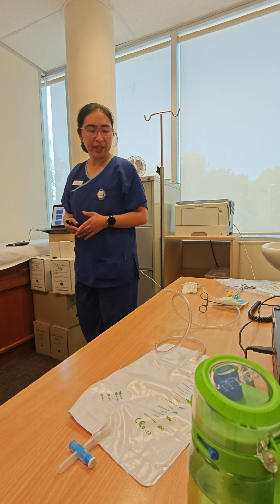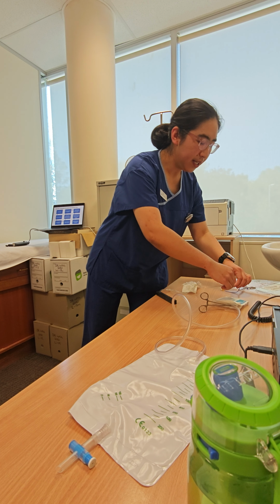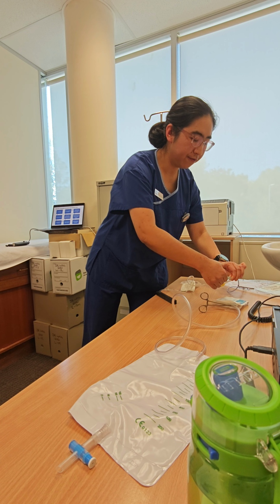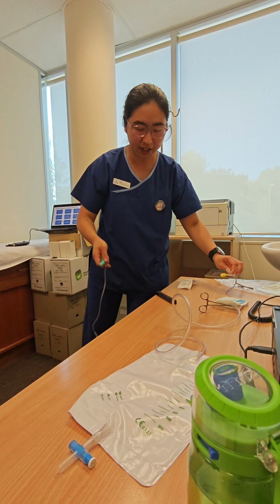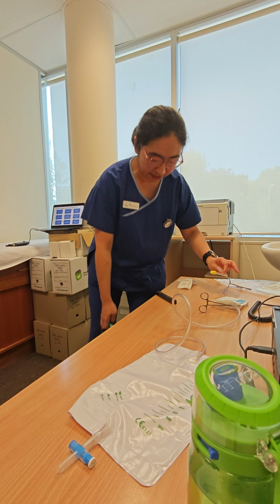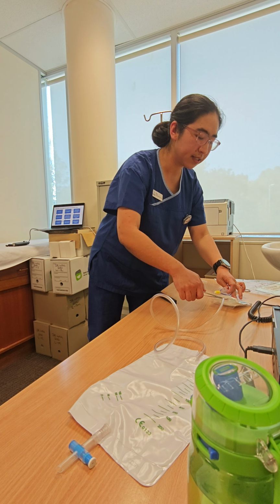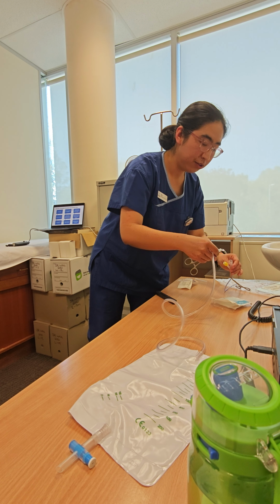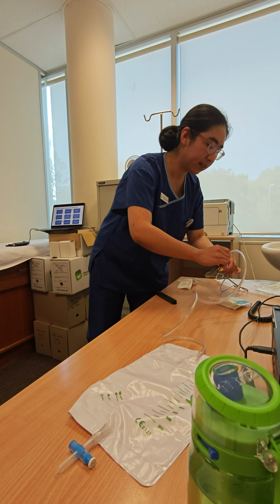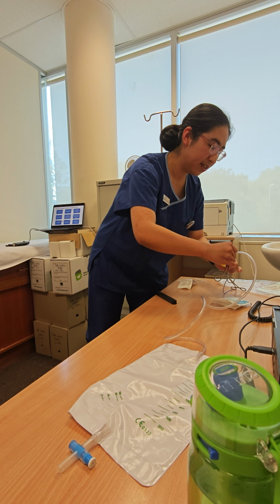If there's a leak, we're gonna leave that catheter in. So what we're going to do, we just disconnect this. Very tight. We're gonna throw that one in our clinical bin. All right, that's there. And we're gonna connect the urine bag back to the catheter.